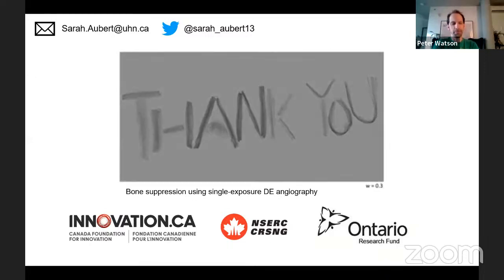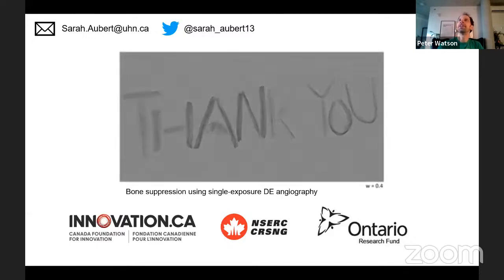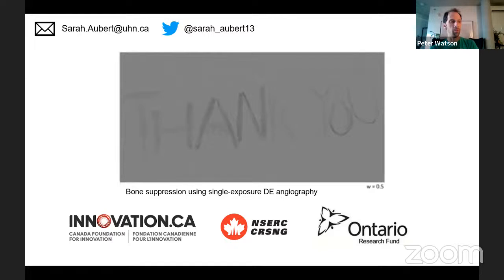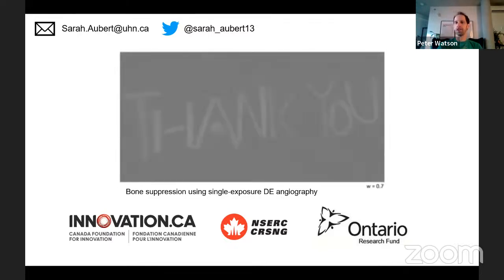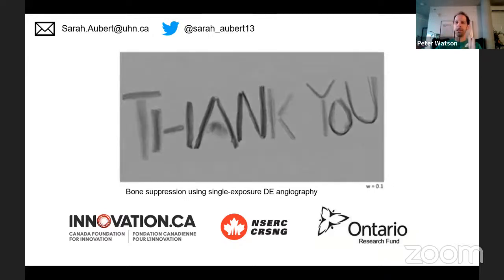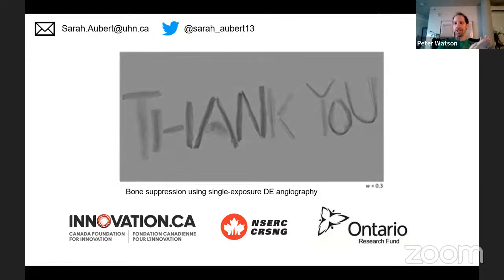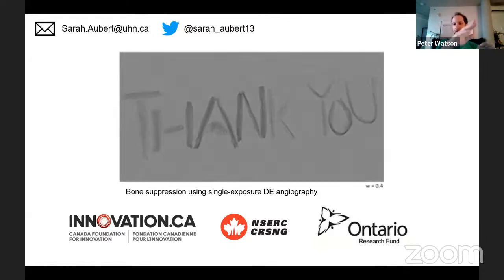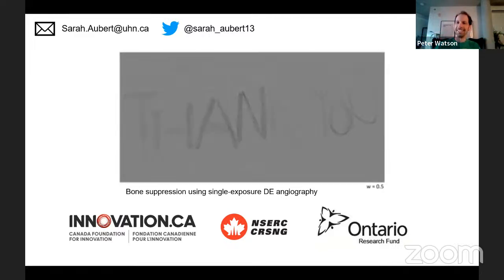That's something I would think would be an issue unless you're able to intelligently tease out what is high frequency noise only, and what is a high frequency edge. I'm not sure if you ever displayed what those correction images look like, but I imagine they look uniform wherever there's nothing happening, and then as soon as you hit the edge of your tube, you see a line. Yeah.